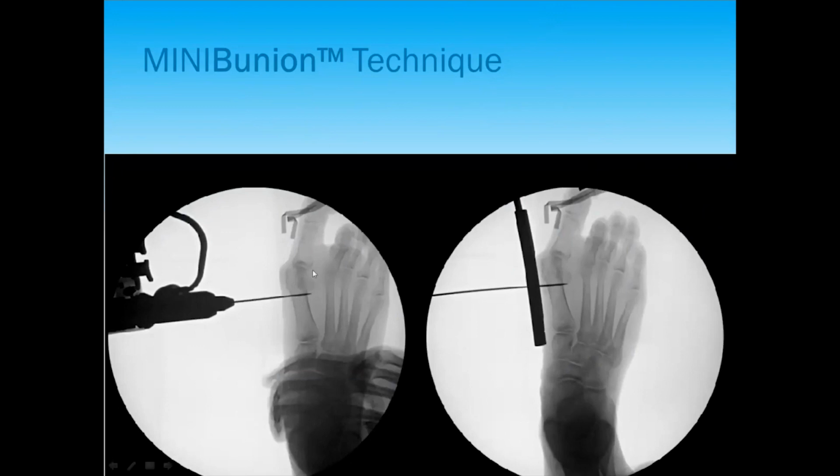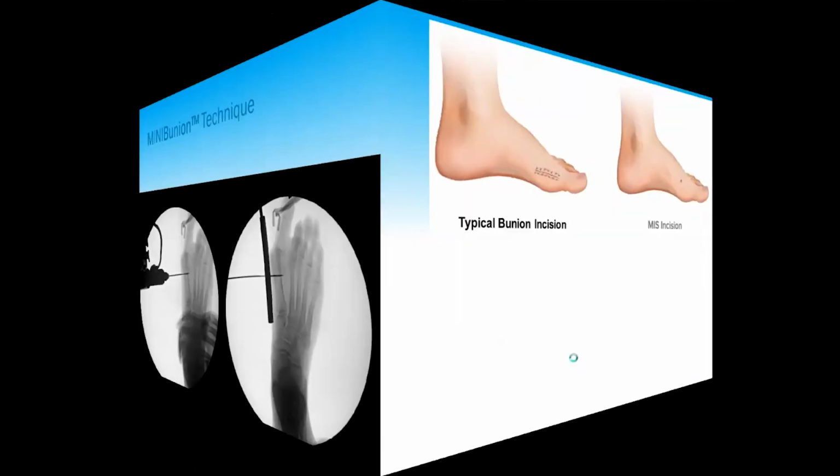Then you put on this guide which tells you whether it's a long or short implant, meaning the intramedullary portion. You don't want too long of an implant that goes deep and would invade the Lisfranc joint. You want to make sure you have the right depth. So this guide on the medial side of the foot has 2 notches to determine whether it's a short or long implant that you put in.